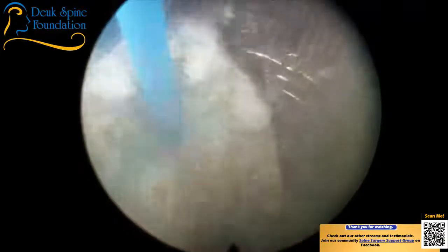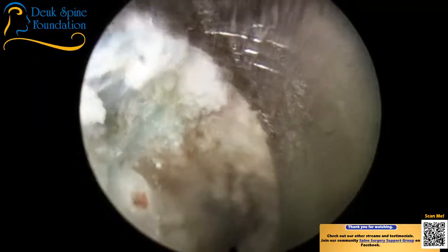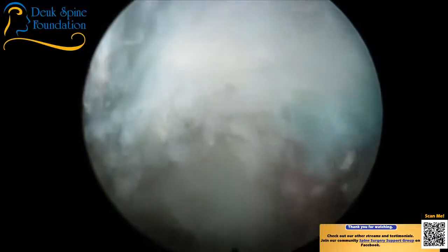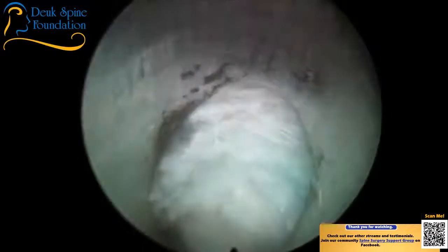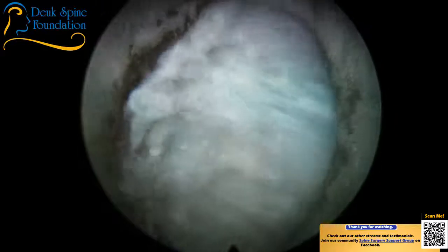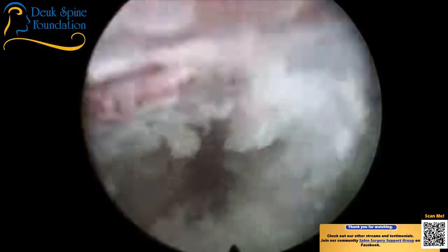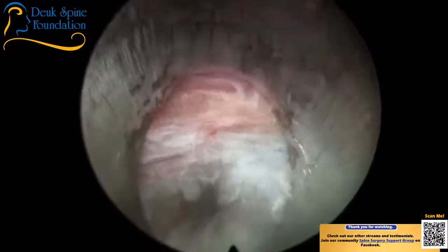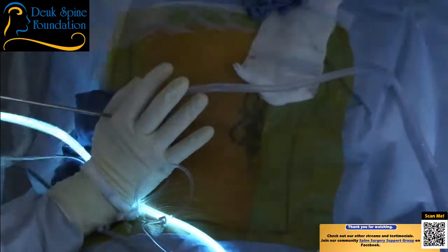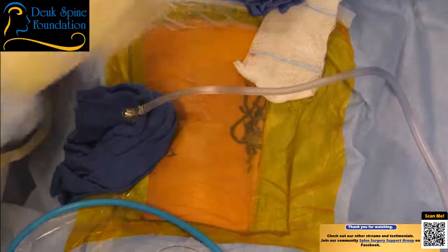All right. Laser off. So the nerve root's going to be right here, and it's actually in that soft tissue there. So you're not going to be able to see the dura. Okay. Done. Off scope. Thanks.